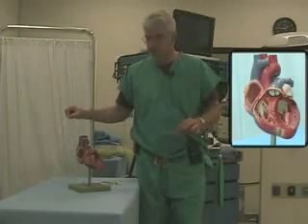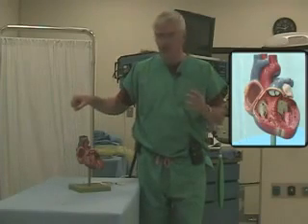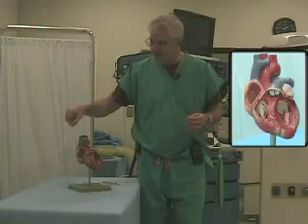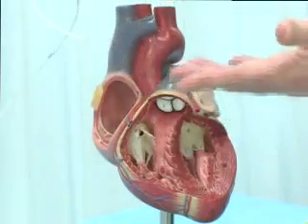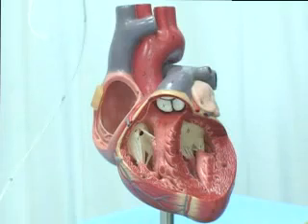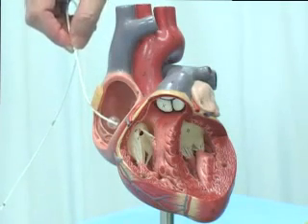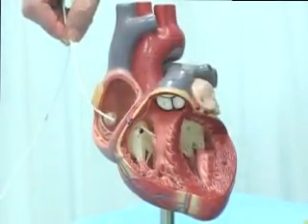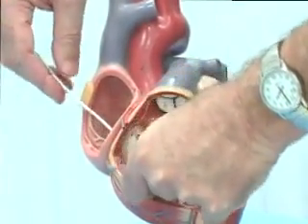First, we'll describe everything in a perfect world. When you introduce the PA catheter, usually through a right IJ stick, it comes down and you can get a CVP number. One thing to remember: the balloon is like a little air bubble, and air bubbles float to the top — that's what you're doing when you're 'floating' a Swan. At about 20 cm you inflate the balloon and feed it through, floating it into the right ventricle.